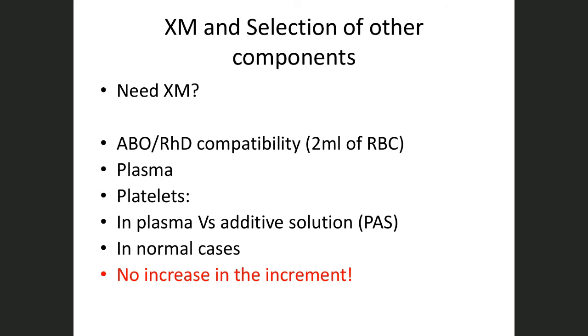Now, platelets, sorry. So platelets, do you think they should be ABO compatible, especially if not contaminated? There is no need to be ABO compatible. Okay, I'm talking now about platelets. So for B, I can provide him with platelets from A.